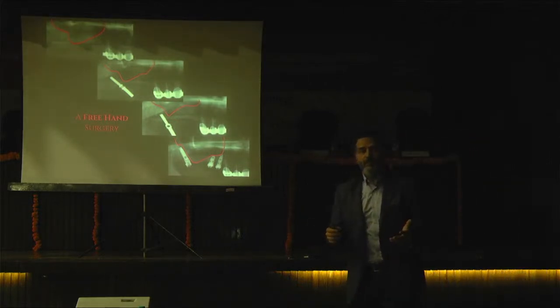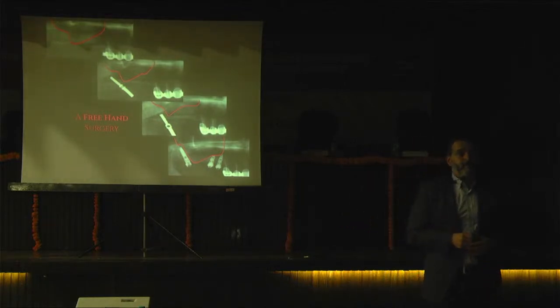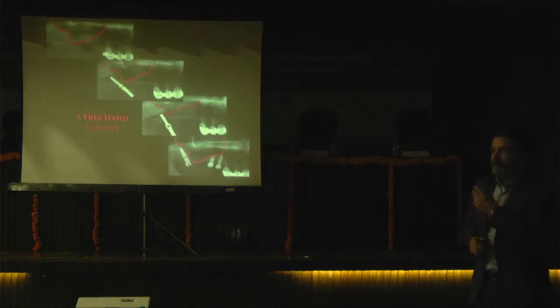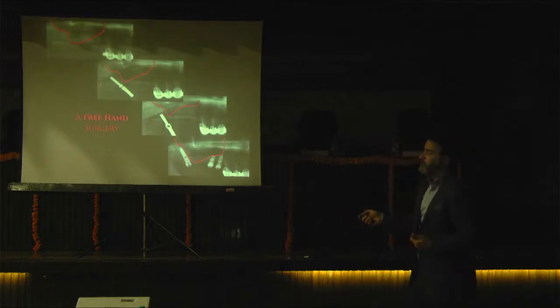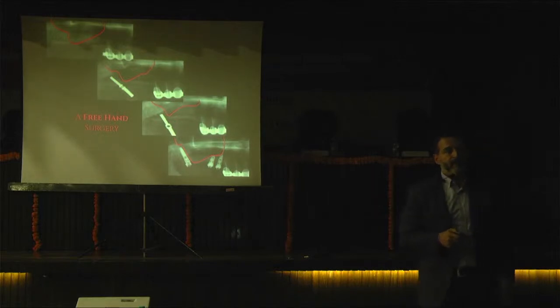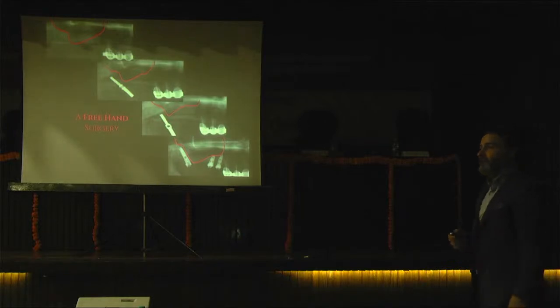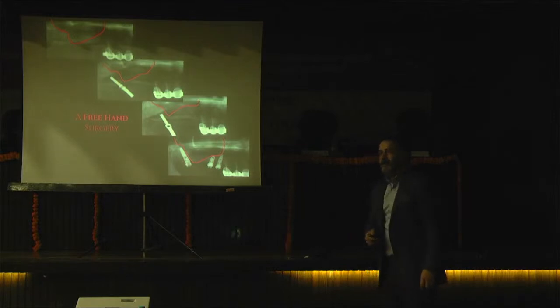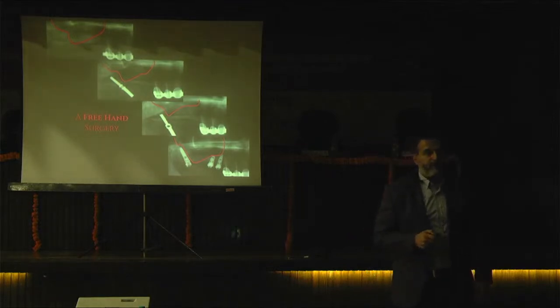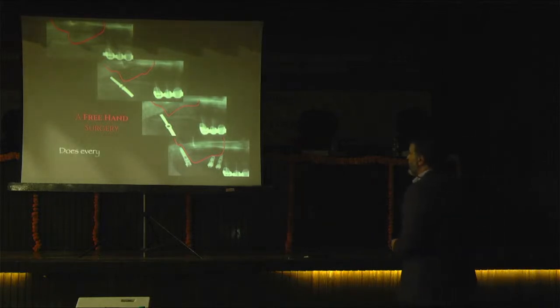With a 3D machine, it is possible to do so many things. But I had a 2D machine, a panoramic X-ray, and what I did, first I dug a hole, I made the osteotomy, and after it, I put a parallel pin, and after that, I realized that I was going the wrong way, wrong angulation. And I changed my direction, and then placed the implant only touching the floor, the posterior wall of the sinus.